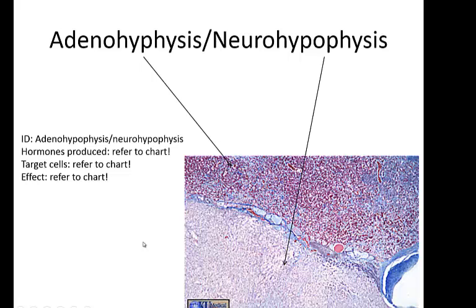The neurohypophysis really looks like blue cotton candy under the microscope because it's made of pituicytes. It's made of neural cells, where the adenohypophysis is colored beautifully, like stained glass. There's lots more color in the adenohypophysis. It is made of endocrine tissue. So two totally different tissues here. Endocrine tissue, neural tissue, hence the name. Adenohypophysis, spelled wrong, whoops. Neural tissue, neurohypophysis.